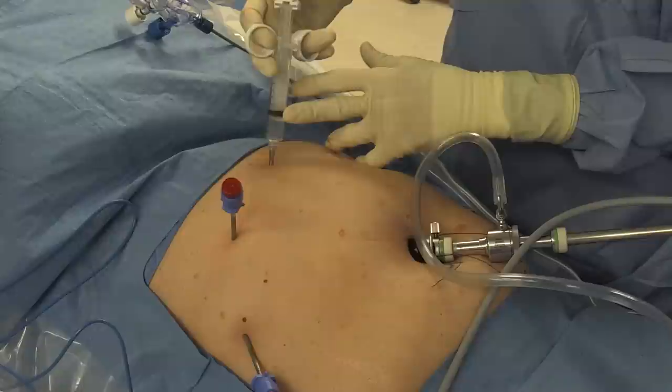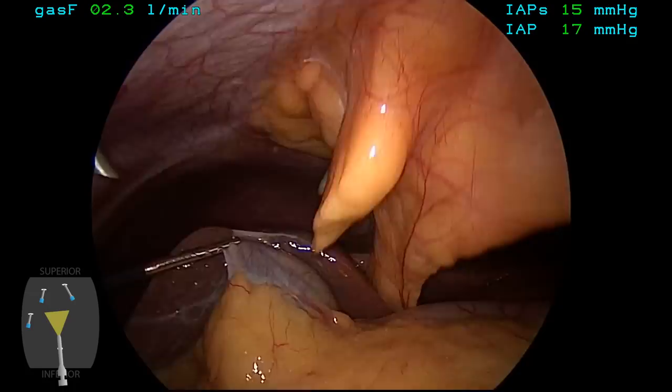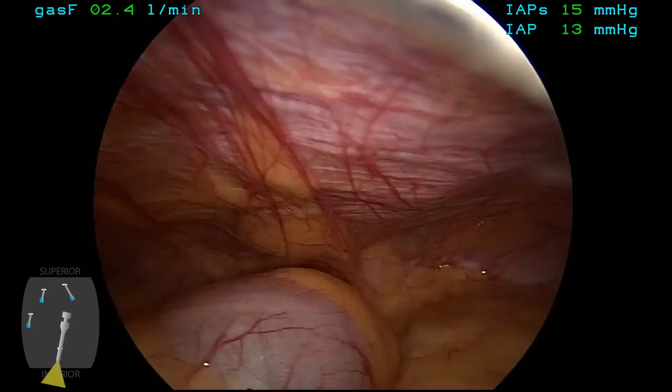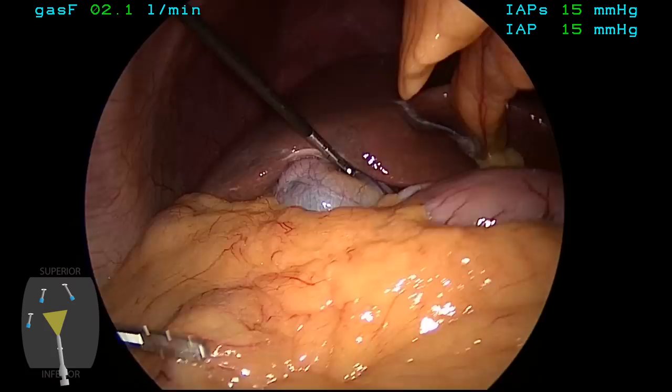Finally, an epigastric port is placed high in the epigastrium, in the midline, to come in just to the right of the midline so it enters into that pre-peritoneal fat just to the right of the midline adjacent to the falciform ligament. Alternatively, one could use a 5-millimeter port at this site. Inspection is carried out of the peritoneal cavity now that we have ancillary ports in, just to examine this small hernia that's in the right inguinal floor.